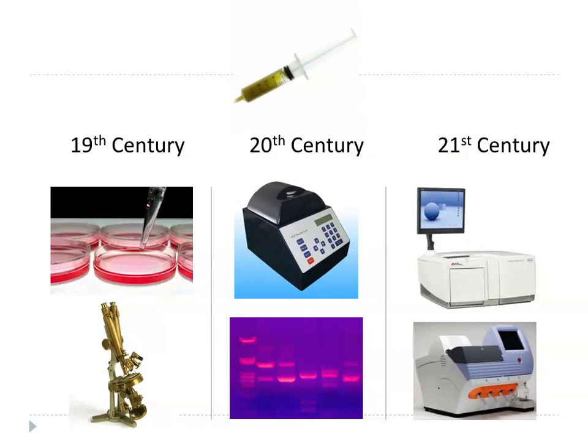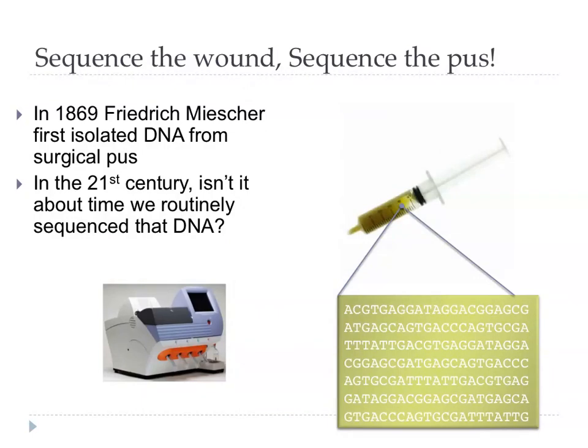So, in closing, in the 19th century we had agar, or at least we had solid media, and we had microscopes. Towards the end of the 20th century, people started using DNA approaches, but I think in the 21st century we're going to start moving towards whole genome sequencing and sequencing as a kind of assay, as a diagnostic modality. And there's a certain kind of aptness in this, because DNA itself was first isolated from surgical pus, and so I say perhaps we should close that loop and say let's go back to basics and start looking at the DNA that's in pus by sequencing it routinely as our diagnostic assay.